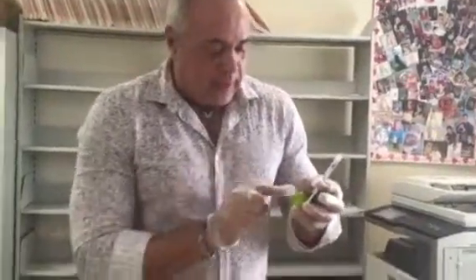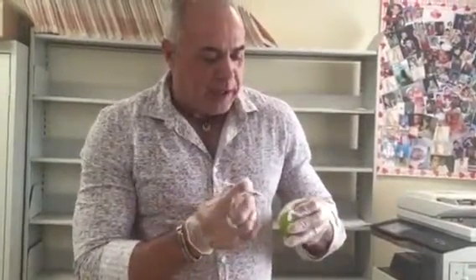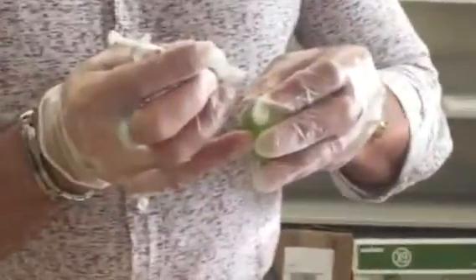Now you have to choose where to give the injection, such as the arm or abdomen. In this case, we are using a lemon. The site for injection should be clean and dry. Pinch the skin and push the needle in at a 45-degree angle.